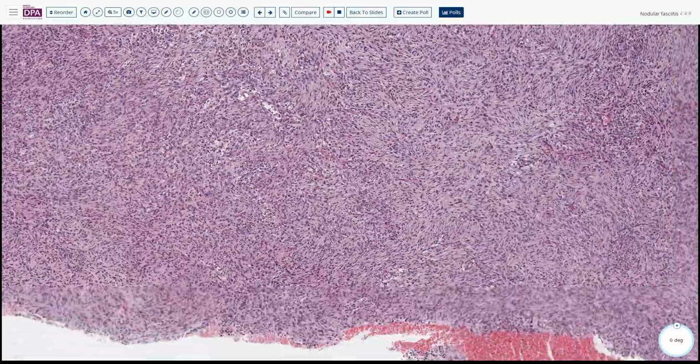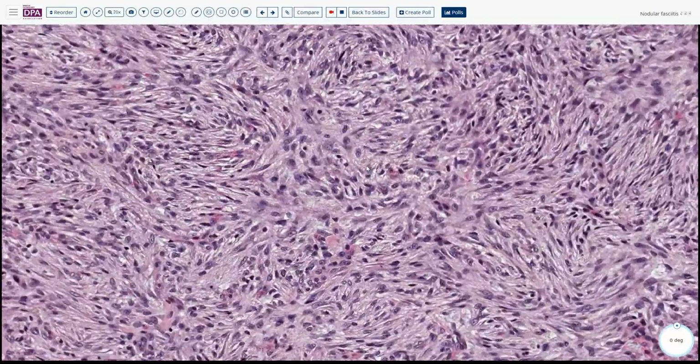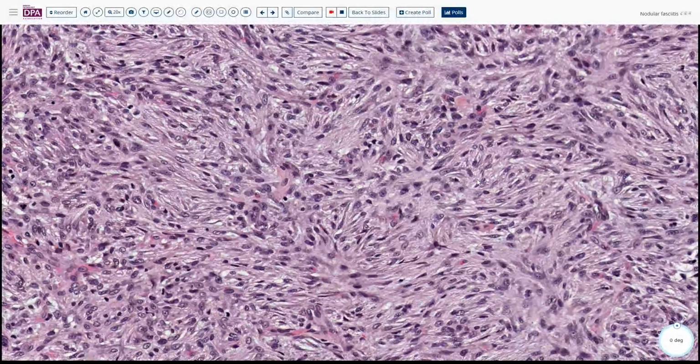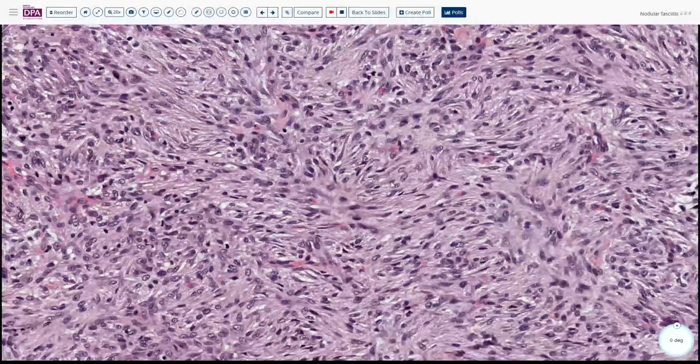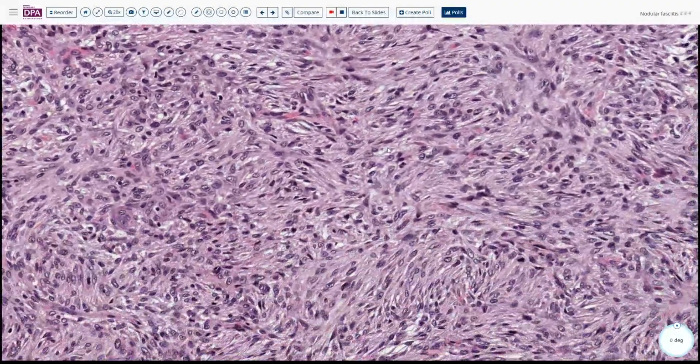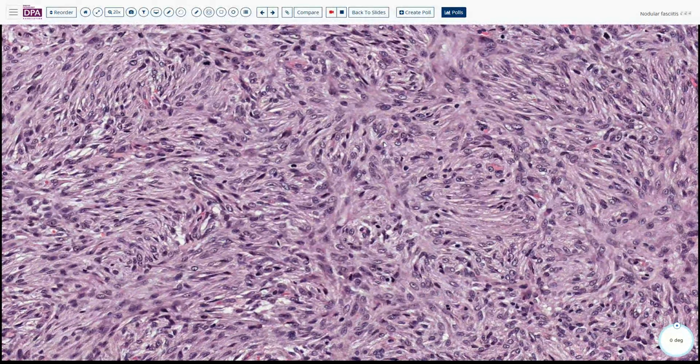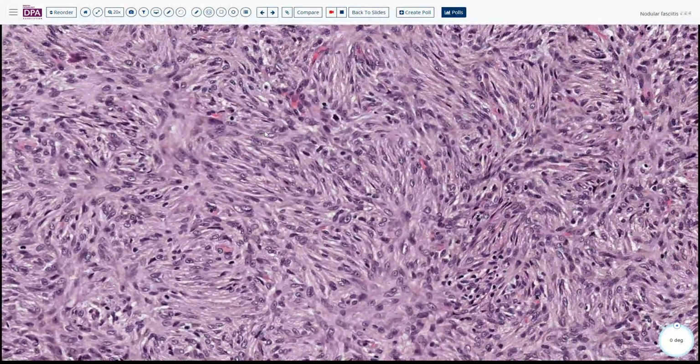And in this area, you can see the so-called tissue culture-like fibroblast. But honestly, from my eyes, it kind of overlaps with the IMT. But you can see, as I go through this high power for a little bit, it is not really easy to see tons of inflammatory cells.